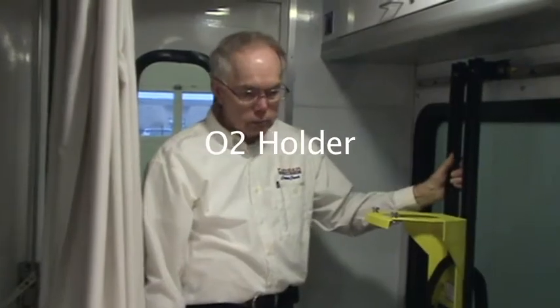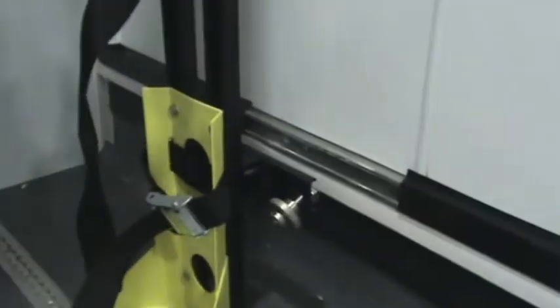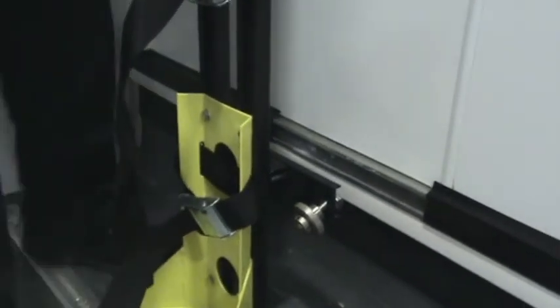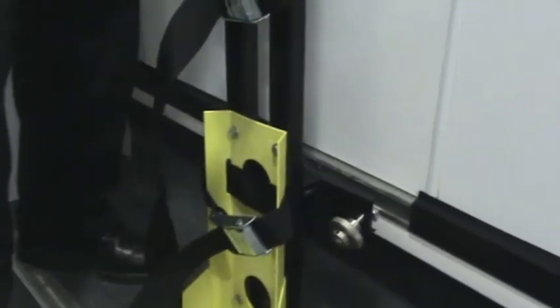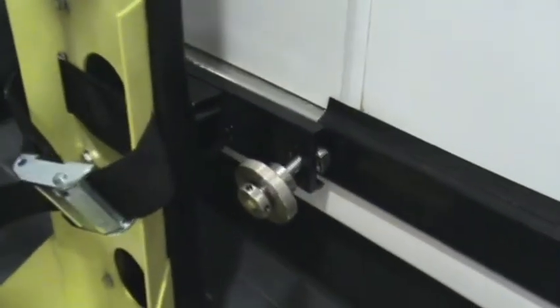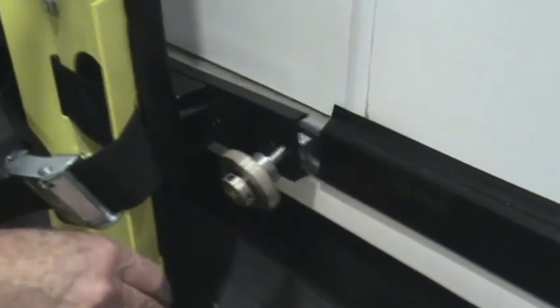Next we're going to demonstrate the installation of the oxygen bottle holder. You'll notice a cutout in the trim panel at the lower bracket. We're going to roughly align the oxygen holder with that cutout.